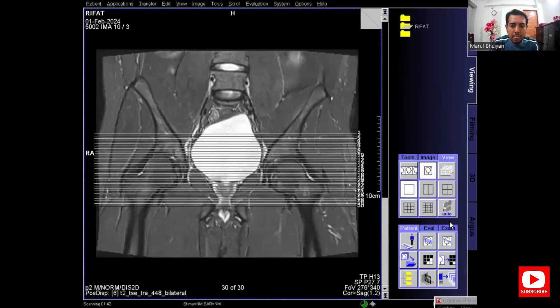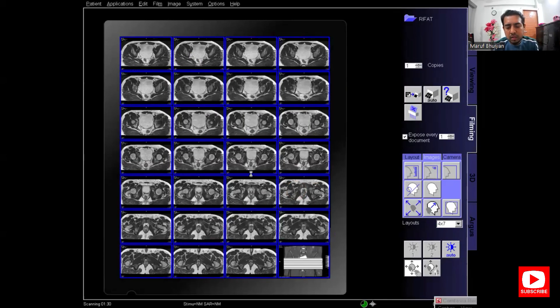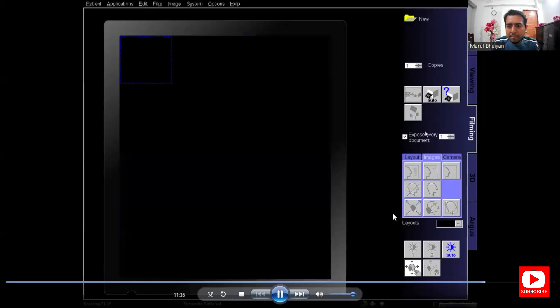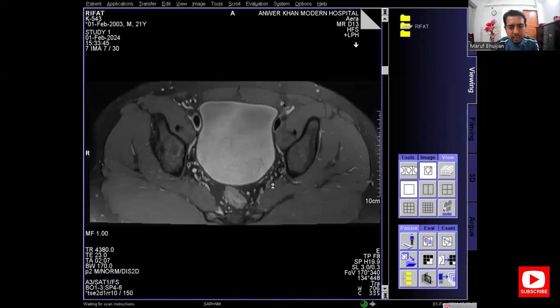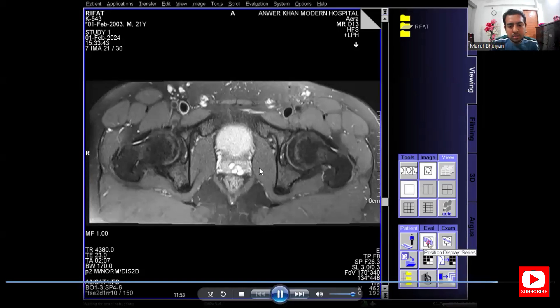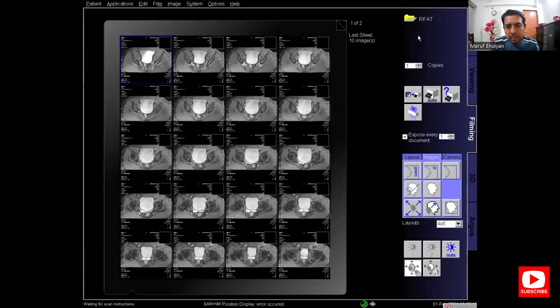This is the reference image — send it to the film, delete one image for the reference image slot, select the film, and remove the reference images from all other images, leaving one reference image. Print the film. The one remaining film to print is the PD fat sat axial.